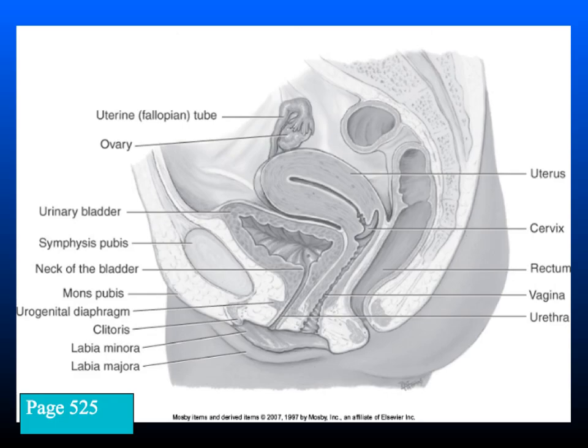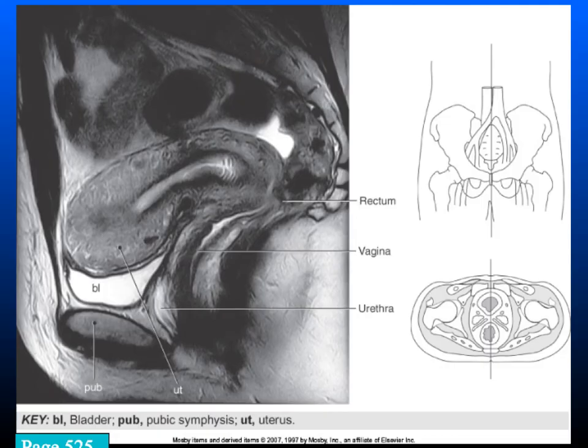And I think we have a better image of it on an MRI, a sagittal image of the uterus, where the muscle of the uterus looks really homogeneous, and inside of it looks lighter because there's fluid inside of the uterus. Let's get rid of my coloring.